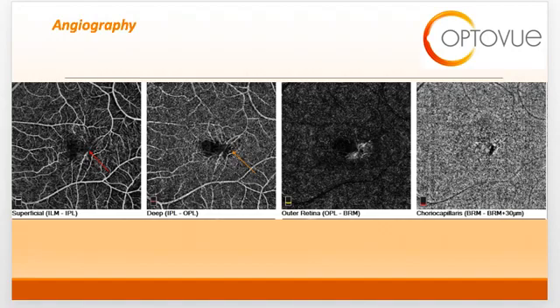Over time, these abnormalities will extend anterior to the superficial capillary plexus, where you can see the changes again in the parafoveal temporal part of the scan with the red arrow. Over time, these changes in the inner retinal plexi — the superficial and deep — can extend to the outer retinal space and form a subretinal anastomosis. You can begin to see in the outer retinal space here a hyperreflective area, which indicates that there is a beginning of some subretinal involvement.